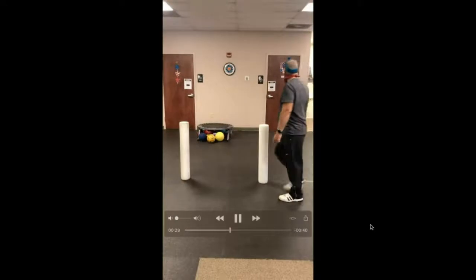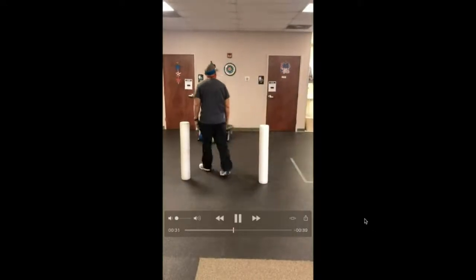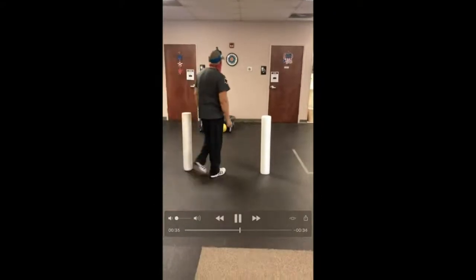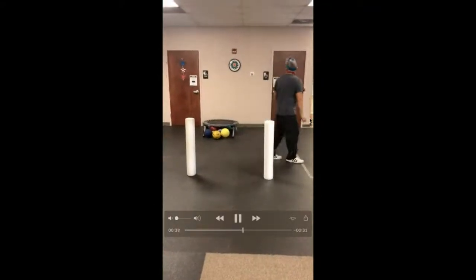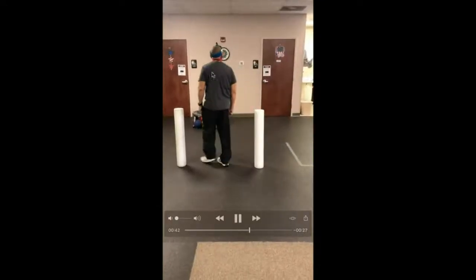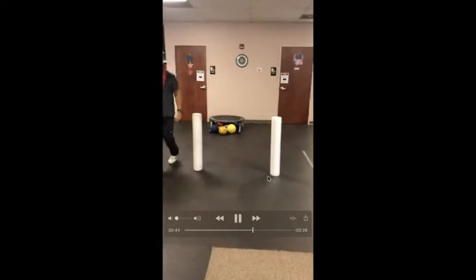All right. So going through, as he's going to the left side, he likes to come back, and he's precise coming back onto the target on this side. As he goes through, he has to take a wider excursion here, and he can't get the laser back up there very quickly.